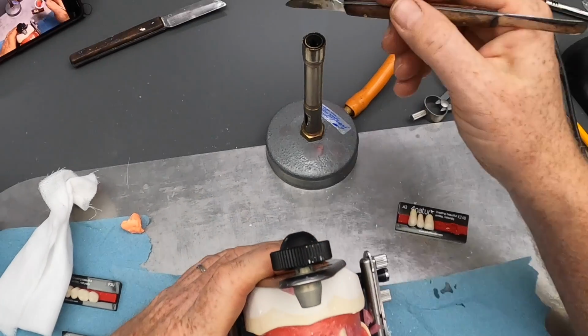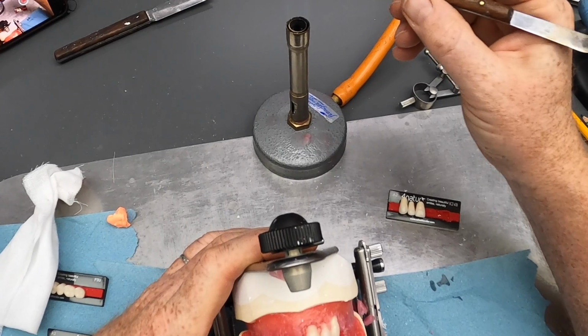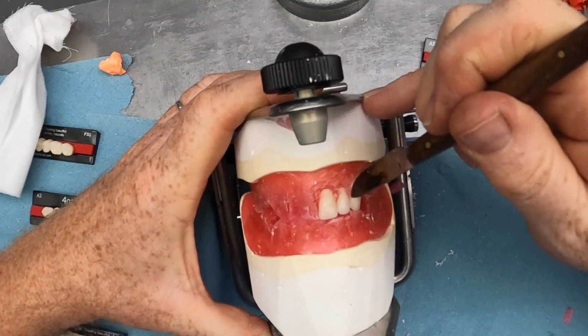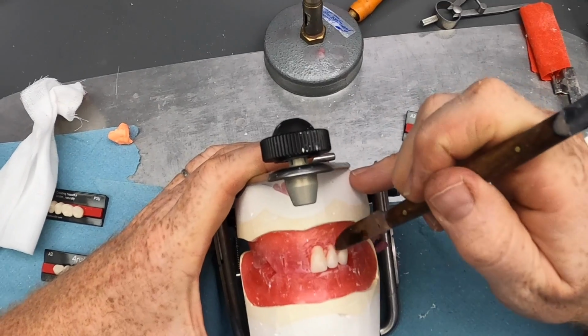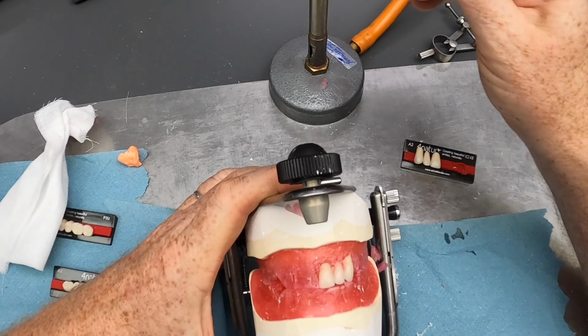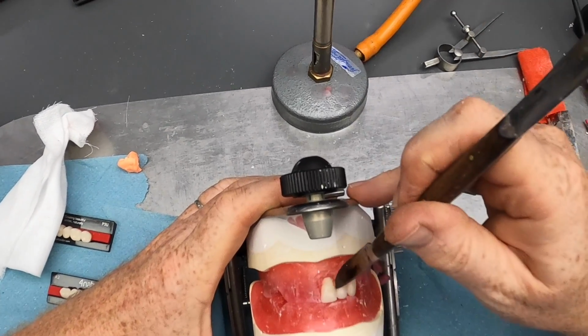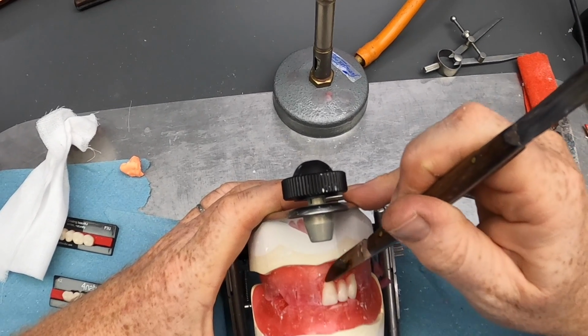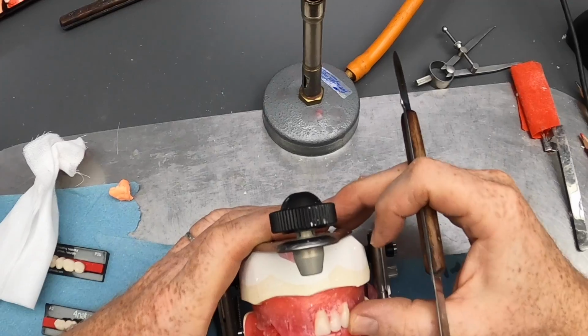And then before we go any further, I'm just going to make sure that these don't fall out, so I'm going to get a hot knife and just run around each, not trying to do the gum work as such, but just making sure that they stay nice and secure while we do the remainders.